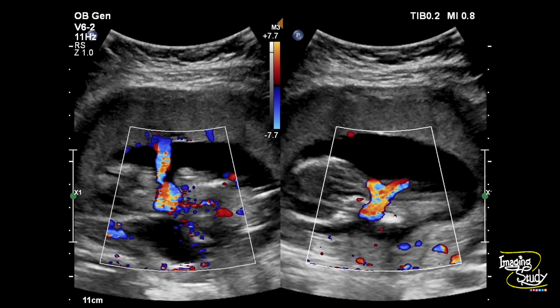Here you can see the vessels are wrapped tightly around the neck. This is the placental inserting site, and these vessels are wrapping the neck very tightly.